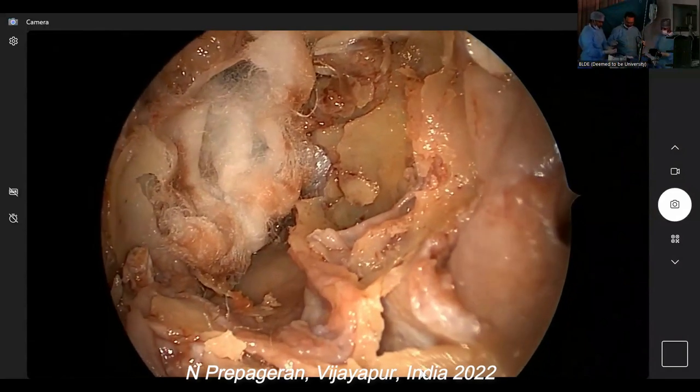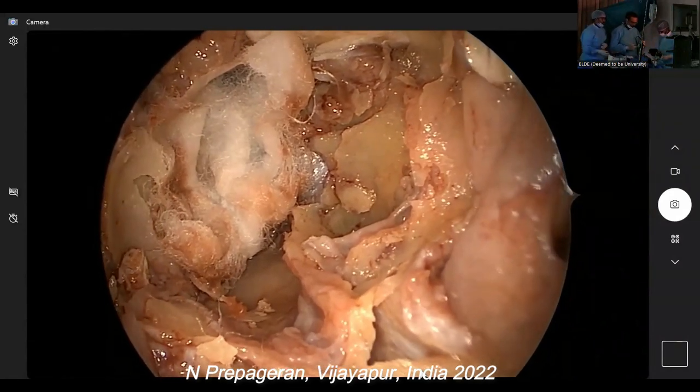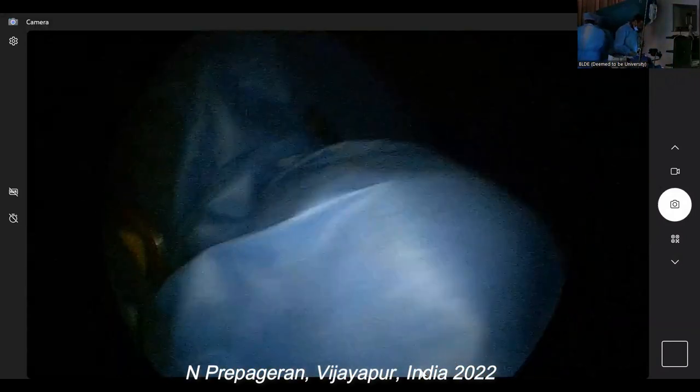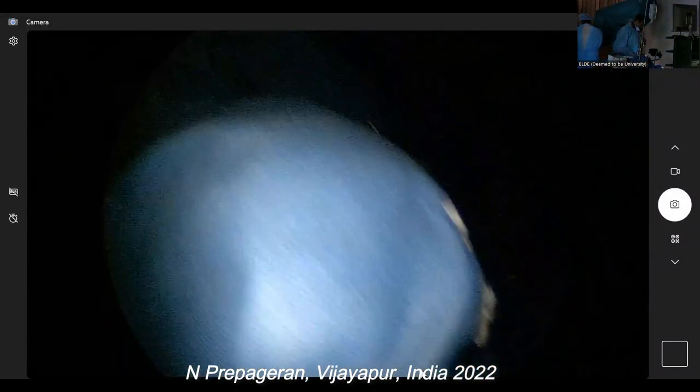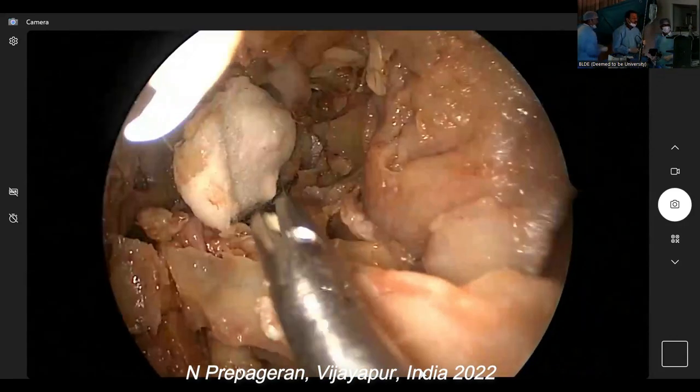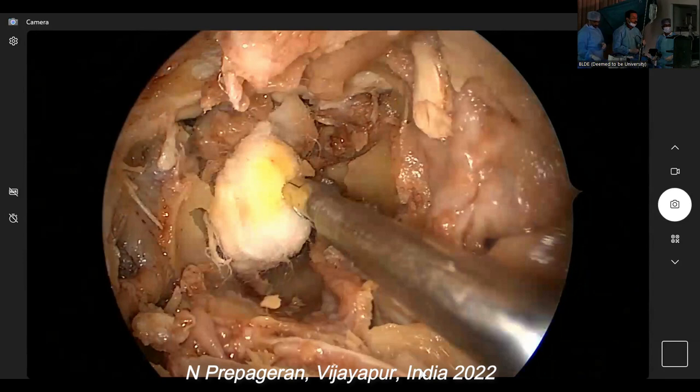No, just a cotton ball. Just give me that. Okay. Put a piece of fat on top of the gasket flap.